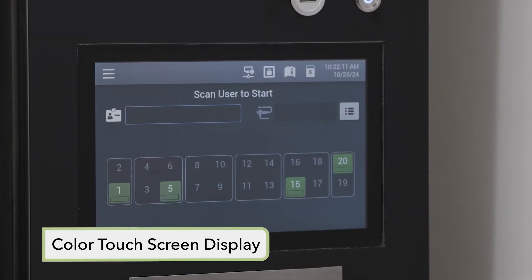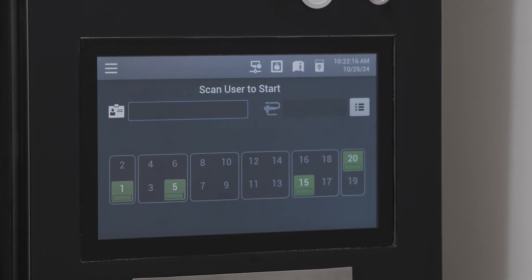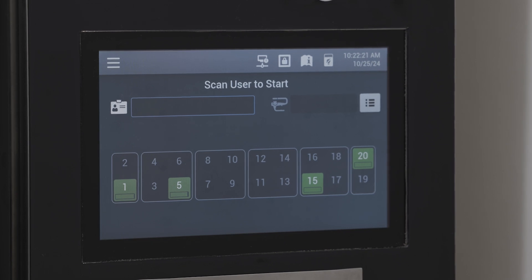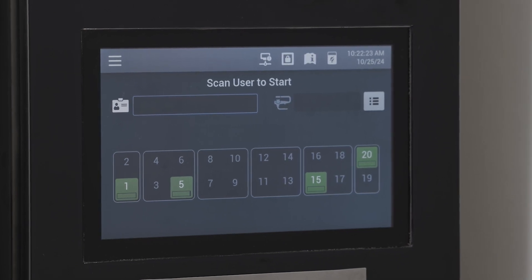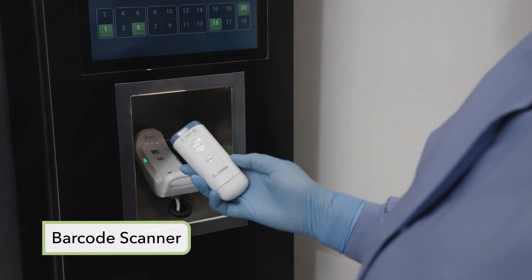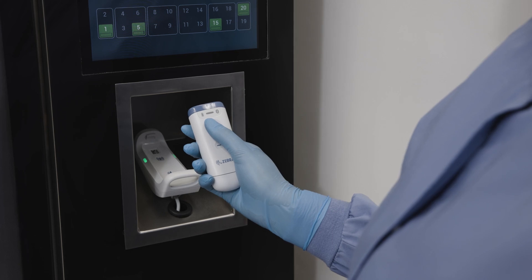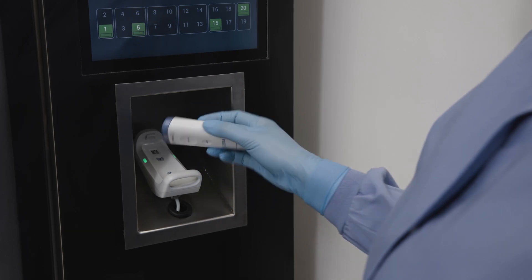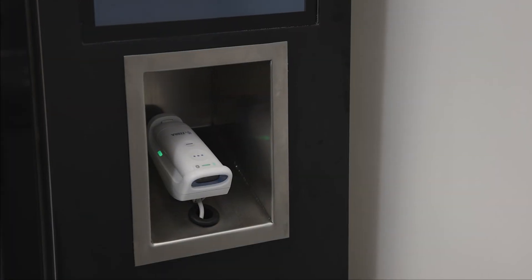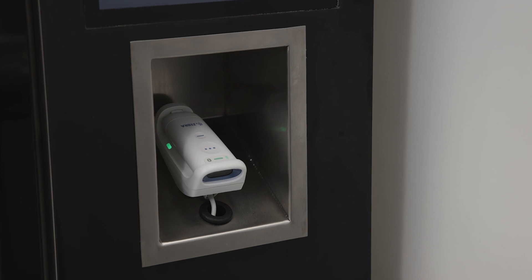All functions of the cabinet are controlled via a color touch screen display located on the control cabinet. On the main screen, you will find the controls to operate the cabinet, information on which hangers are occupied, and the endoscope storage time status. The barcode scanner allows for ease of endoscope, operator, and supervisor identification. All data regarding endoscope and user loading and unloading is captured with this scanner, unless the data is manually entered. The scanner can switch between a stationary hands-free mode and a cordless handheld mode when the interior of the cabinet requires access.